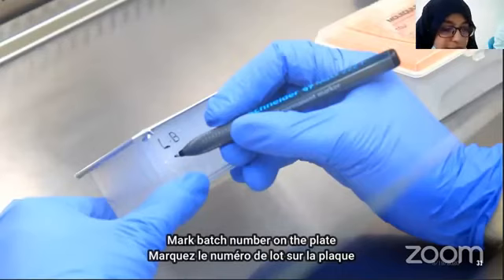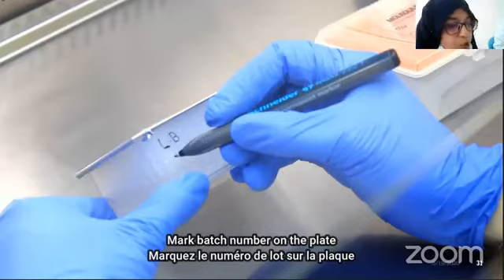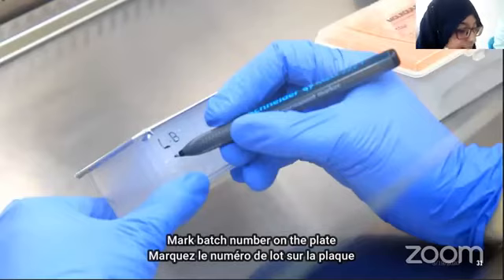If all the samples are negative, there is no problem. But if any one sample is positive, there is a problem. We cannot say which sample is positive, so we have to take out all the samples and extract their RNAs individually and separately. But I think your question is about the separate wells of the positive and negative control.